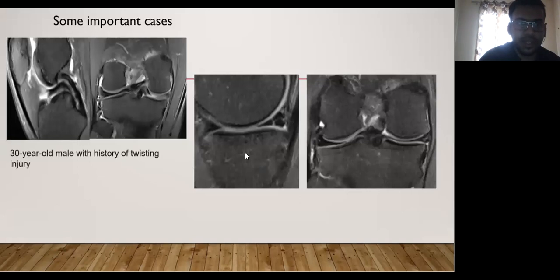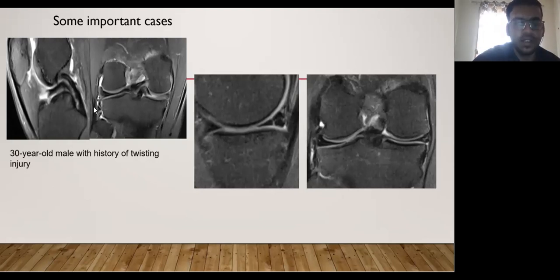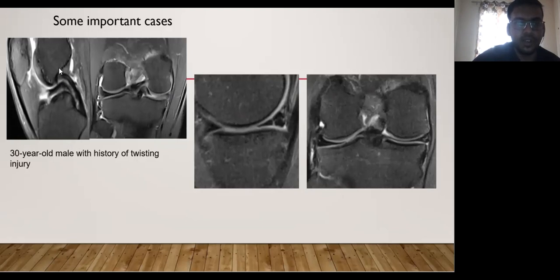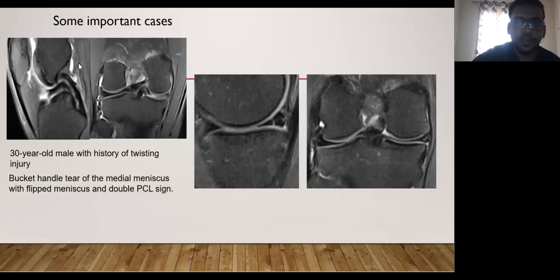This is a case of a 30-year-old male patient with a history of twisting knee injury. On the sagittal and coronal sequences, we can appreciate injury to the medial meniscus dividing it into medial and lateral meniscal fragments. The medial fragment is flipped and reaches the intercondylar notch. In the sagittal plane, it is oriented parallel to the intact posterior cruciate ligament, giving the characteristic double PCL sign, which is diagnostic for bucket handle tears. These are essentially vertical longitudinal tears with extension along the course of the meniscus.